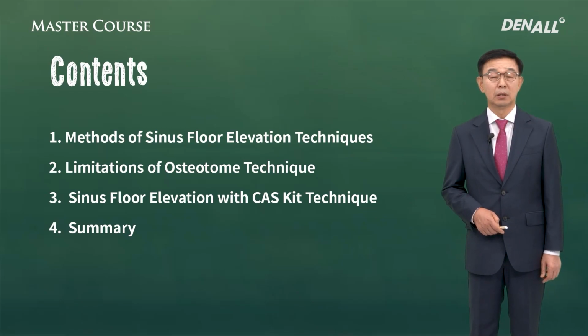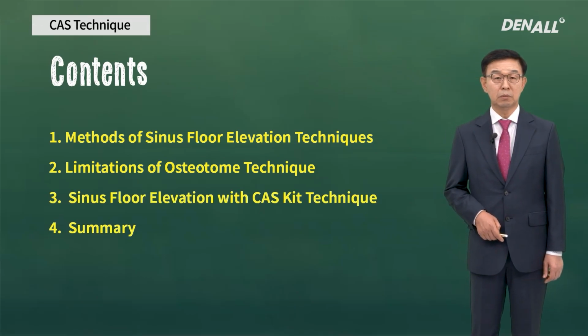The contents for today: the general way to do sinus lift, traditional osteotome techniques, limitations, and sinus floor elevation with the CAS kit technique. These will be discussed.